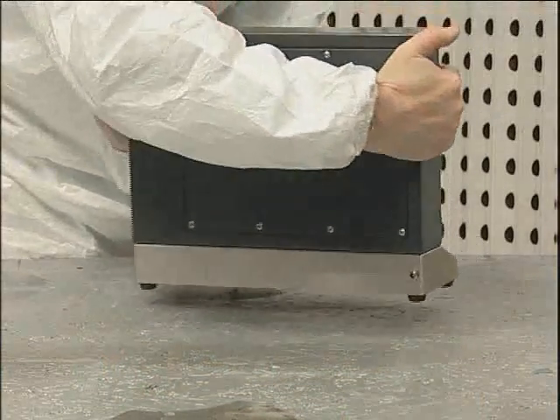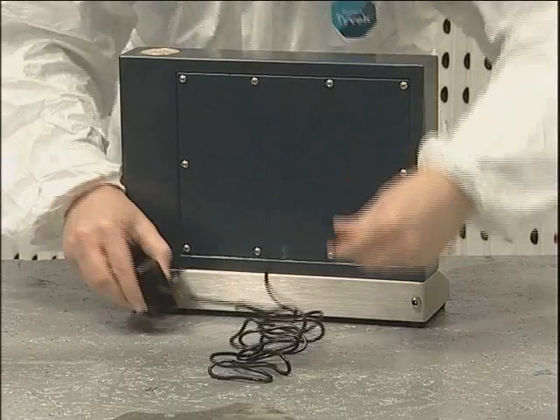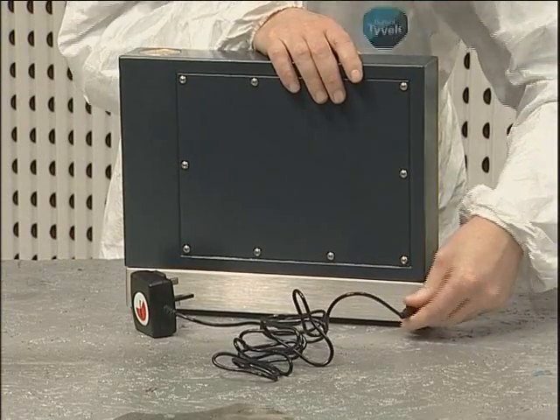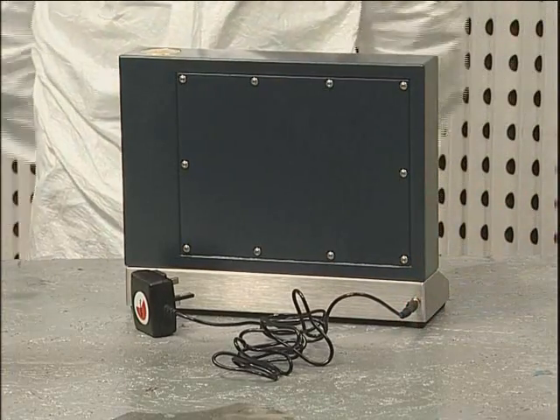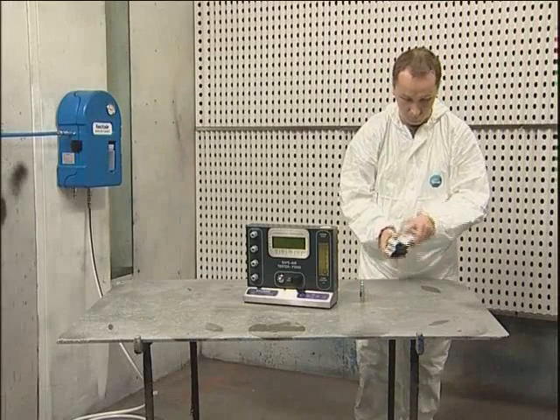If the tester is to be used adjacent to a power socket, the mains adapter may be used. Please note that the unit should be switched off prior to connection or disconnection of the mains supply. The test is carried out using Draeger chemical reagent tubes.